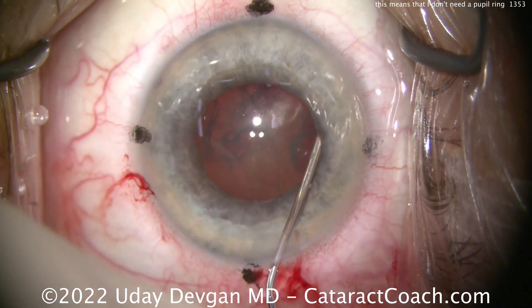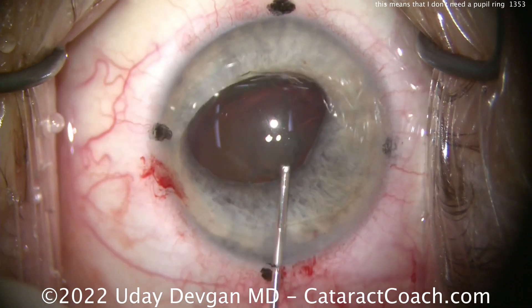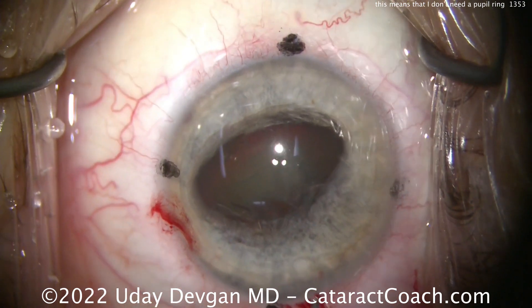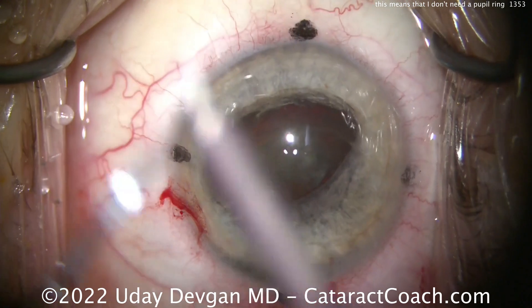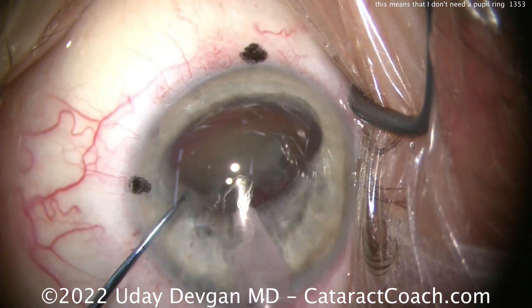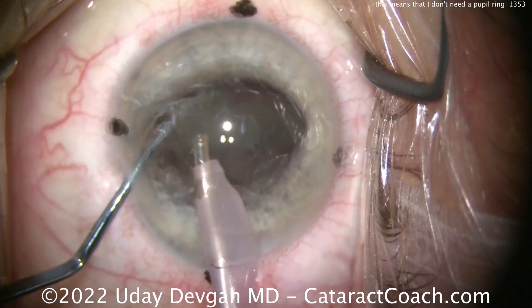Here's the hydrodissection. One thing that's going to be helpful, especially in a Flomax patient like this, is to get that nucleus up out of the capsular bag and tilt it on its side. There's the whole nucleus — the pupil is actually holding the nucleus for me. A little aliquot of dispersive viscoelastic to protect the cornea. Here comes the FACO probe: chop mode, high vacuum, high flow — 40cc's a minute, 500 millimeters of mercury vacuum. Get that chopper around. Boom — there's the nucleus split in half.